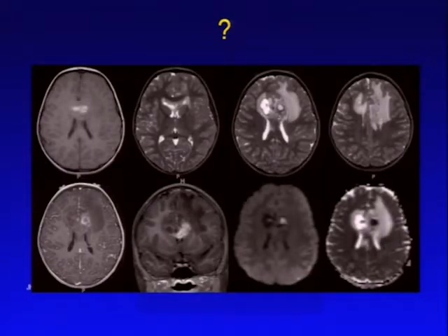Now, this was one of the first cases I had to show during the neurosurgery conference when I started working at Johns Hopkins, being very nervous at this big institution, and this was a follow-up imaging of a butterfly glioma. They didn't tell me it was a follow-up of a butterfly glioma, they just said this is a follow-up imaging, what do you think? Most likely it's a tumor, but I don't see the tumor. I see something T1 hyperintense, a little bit of peripheral enhancement. I see dilated Virchow-Robin spaces, some hemosiderin, and a lot of edema. I don't see really markedly restricted diffusion.